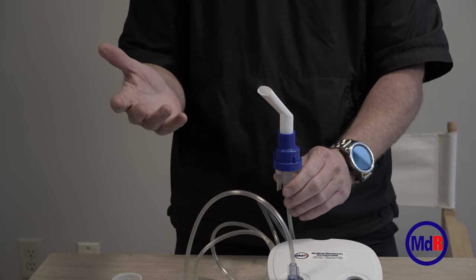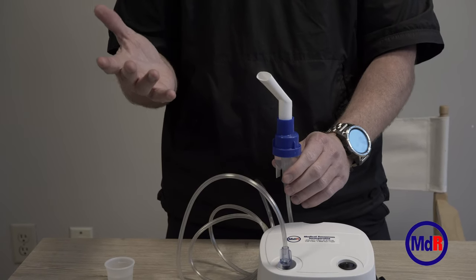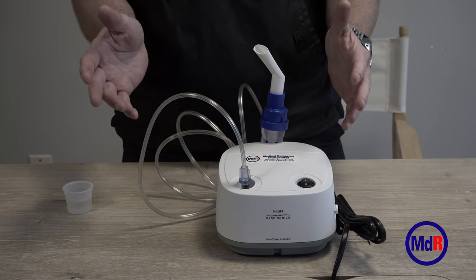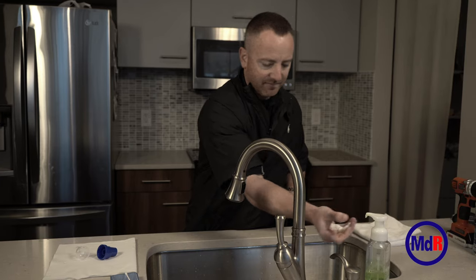Once you have the medicine in the cup and you turn the machine on, you should see what we call aerosol coming out — it's going to look kind of like a white smoke. That's going to help the medicine get to the patient's lungs.